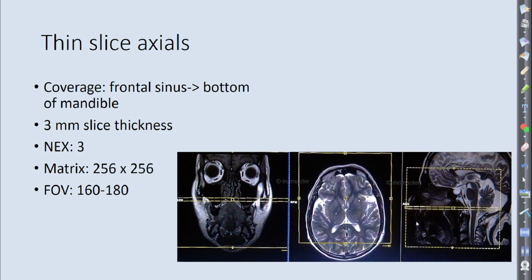Here's your axials. Sometimes they angle it with the hard palate, but we're getting the frontal sinus all the way down to the mandible.